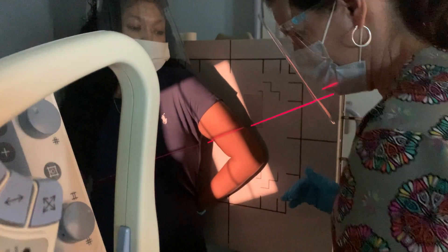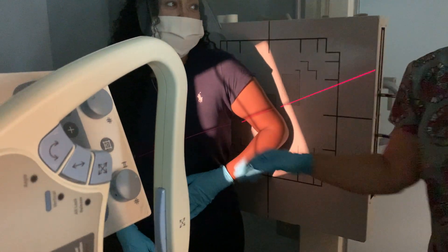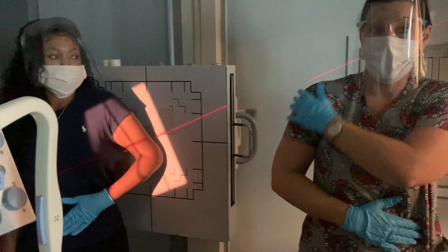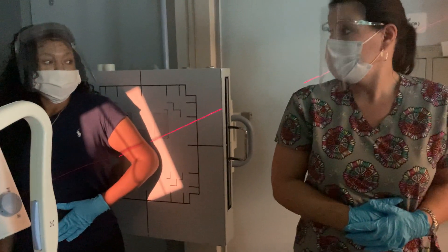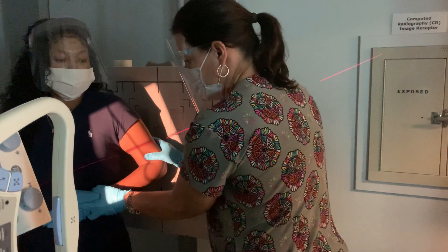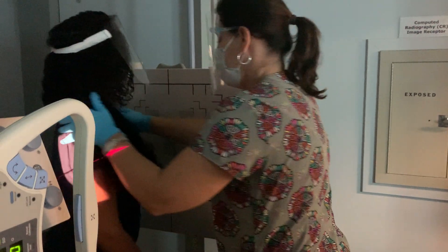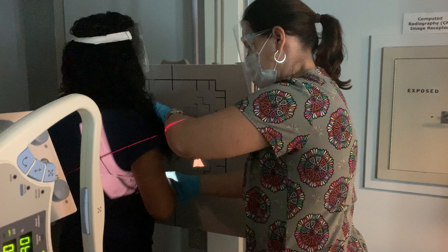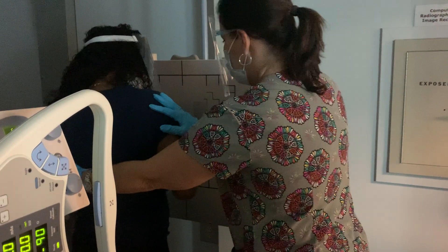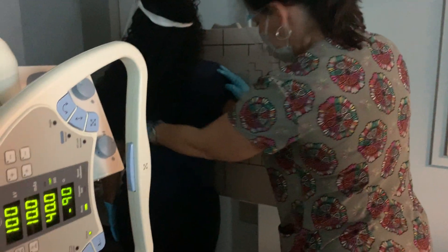So we're going to flip you around. Keep your hand on your stomach like this — think about that. If a patient comes into the department and they've injured their arm, they're most likely going to be holding it like this, right? So we're going to pretend like she's come in and she's hurt, she's got her hand on her stomach. Turn you around, and let me flip arms so it's easier to see with the video. We're going to keep her hand on her stomach and turn her body at an angle with her shoulder all the way up against there.